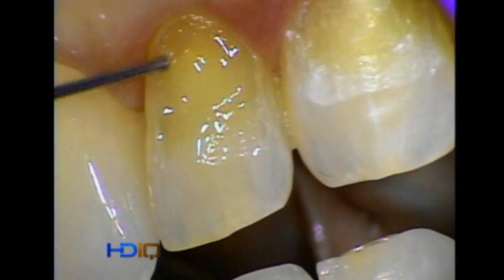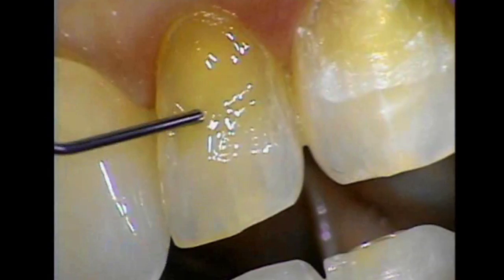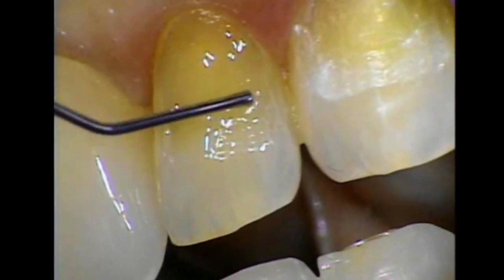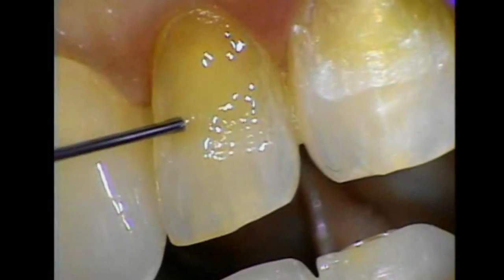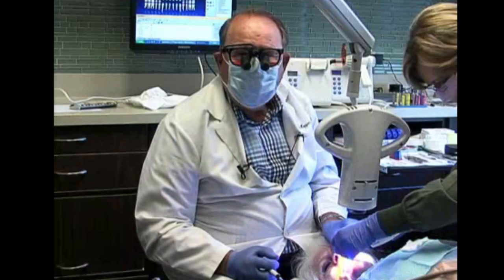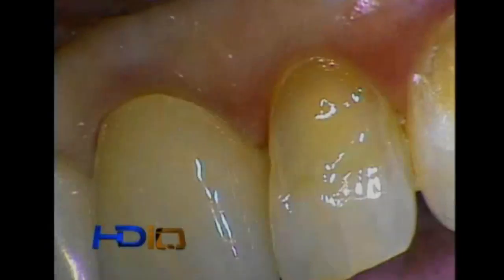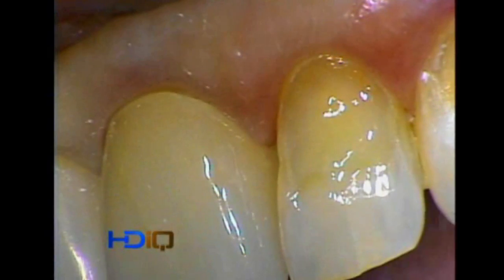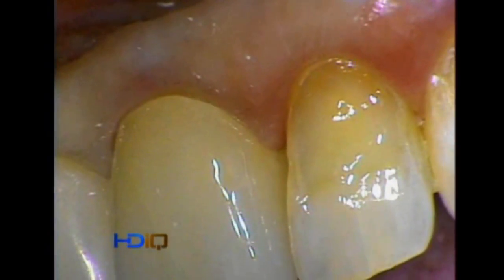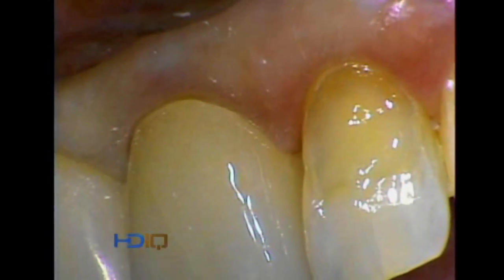I didn't come down here where you can see the margins — I have complete control with this material. I want to put the paste material over the top of it, and this is going to help the paste material go on rapidly. We polymerize it for about 40 seconds, which is all you need. Now, once the flowable microfill is in place, we can easily adapt the composite.